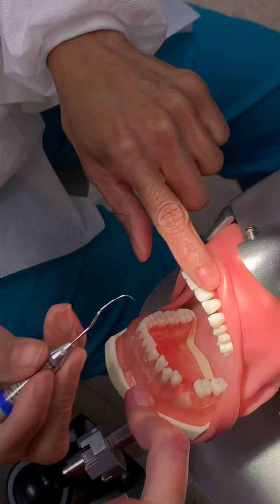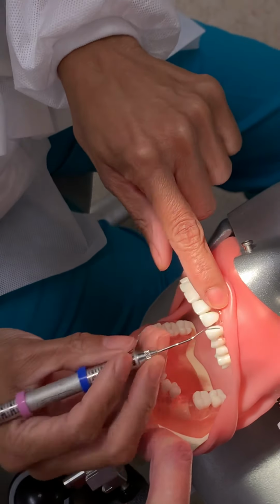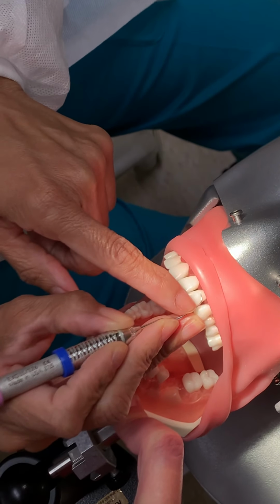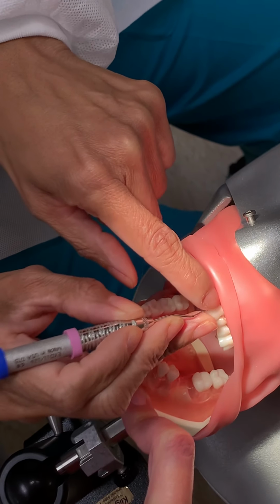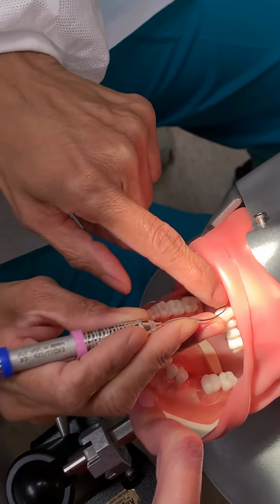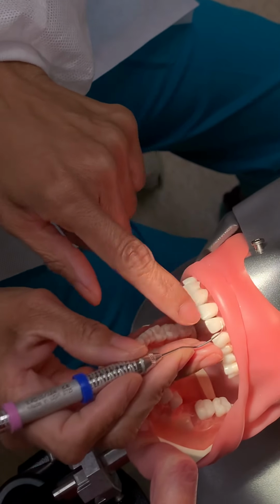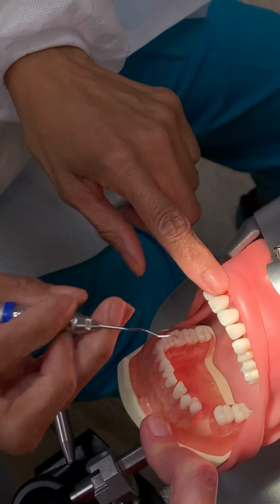Now, if it was the wrong end, if I was coming surfaces towards me, it'd be the wrong end. You see how this is coming, it'd be going up into the gingiva like that. So you don't want that. And you don't want the terminal shank coming up off the tooth either. Like she mentioned yesterday, your terminal shank should be pointing towards the tooth, okay? So it's down like that, and then your tip third is down. But this will be the wrong end. This is coming up off the tooth, and the tip third will be sticking into the gums, okay? So that is your anterior.